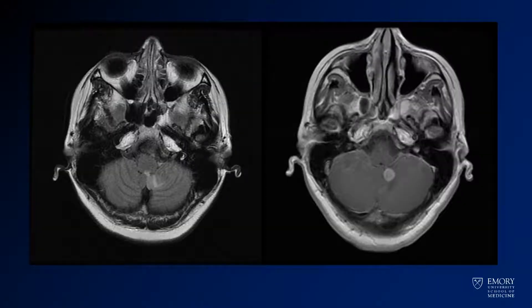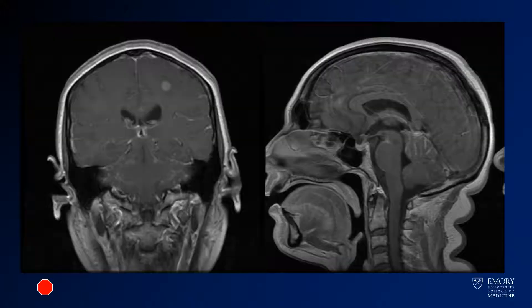Now we have some MR images. This is a FLAIR image on the left and a post-contrast image on the right. Here are a couple more images — these are both post-contrast.